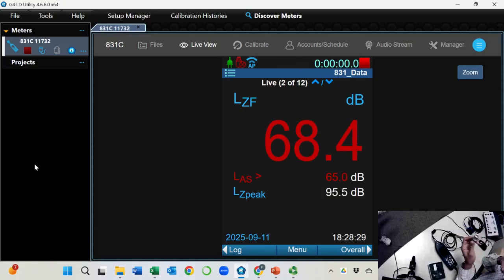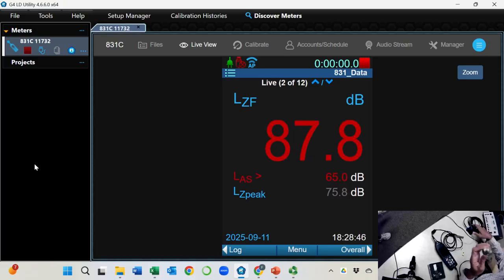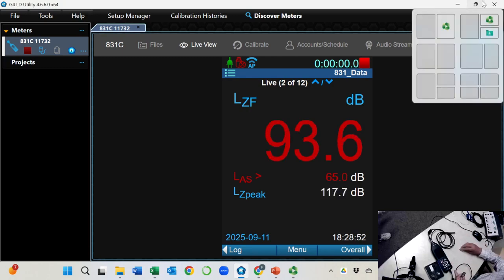From your hearing aid or other classes, is this type 1, HA1 or HA2 coupler? Thank you. Okay. Let me show you the way I remember it. The way to remember it is to take it apart. I'm a naughty boy.